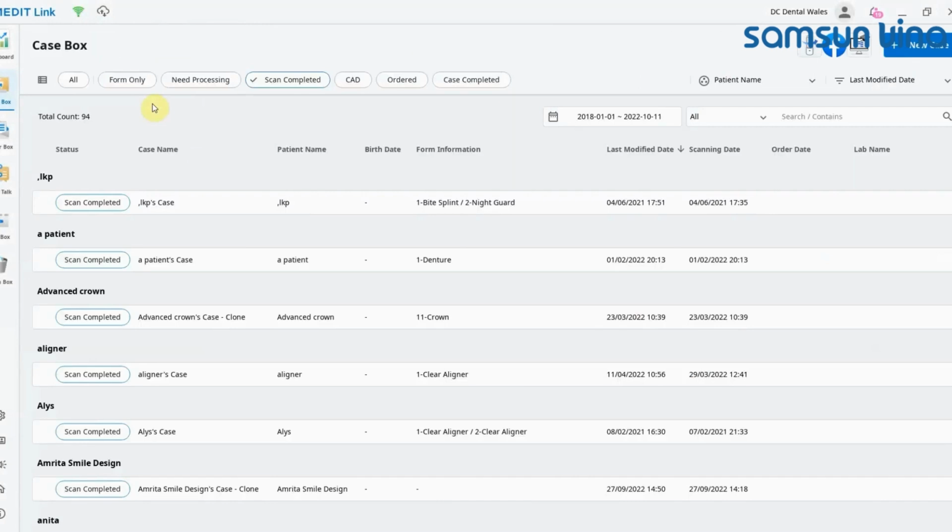Okay, so our next problem is how do I know, or how do I update Medit Link and Windows? So it's really important to keep both up to date in order to get the best user experience. To check what version you're currently on, now I'm on the latest version here, but you can go to the settings cog down here.